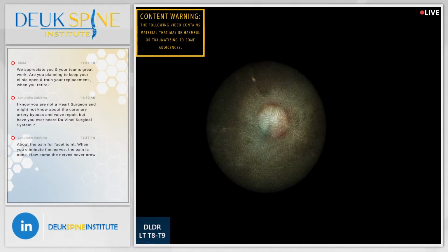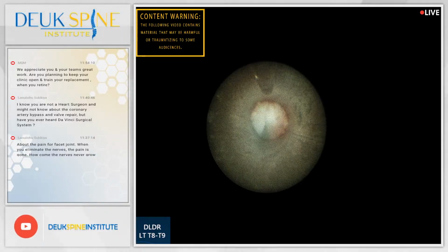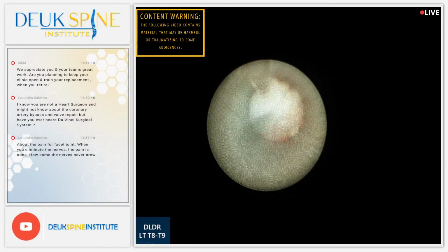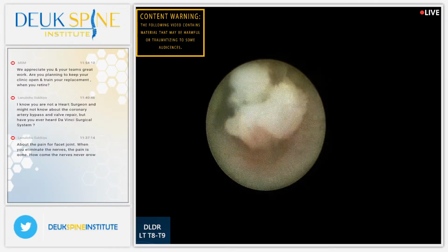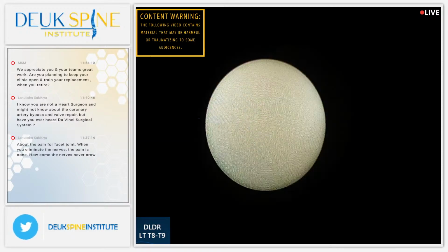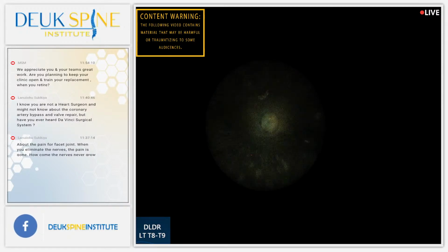I didn't get a number out of him. I feel like this is definitely inflamed and causing his pain. You can see all that there, scar tissue from chronic inflammation. So these are all good signs that we're in the right place to fix the right disc.